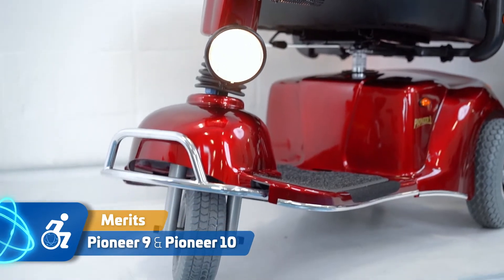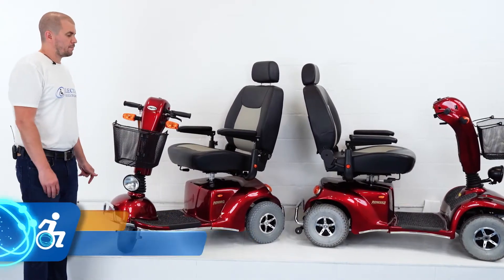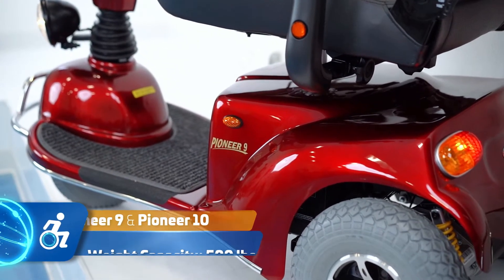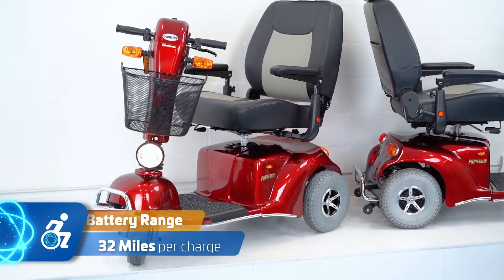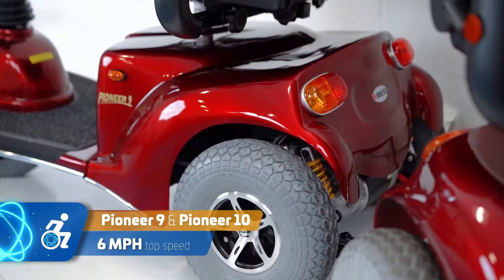This is the Pioneer 9 and the Pioneer 10, heavy-duty bariatric mobility scooters by Meritz Health Products. These are beasts of machines. They have a 500-pound weight capacity, an impressive 32-mile battery range, and a top speed of 6 miles per hour.